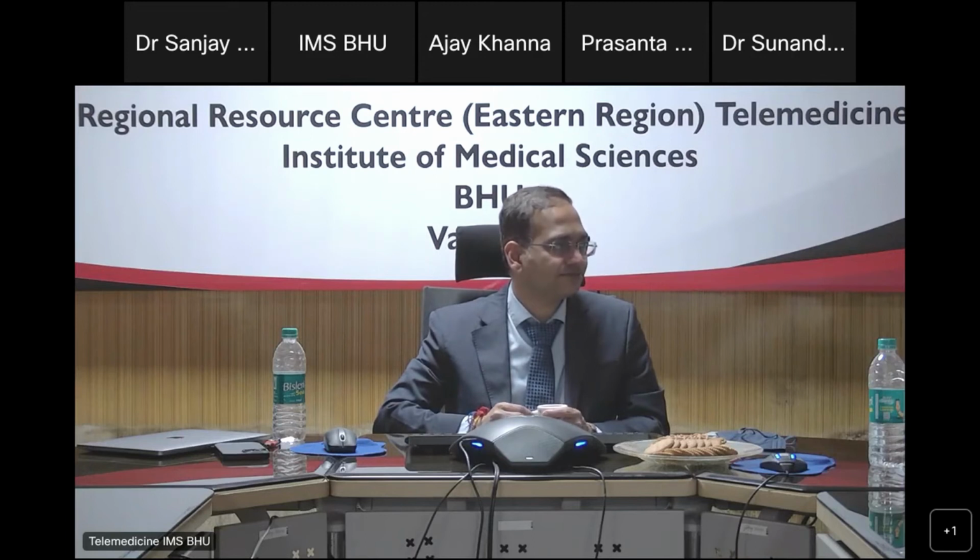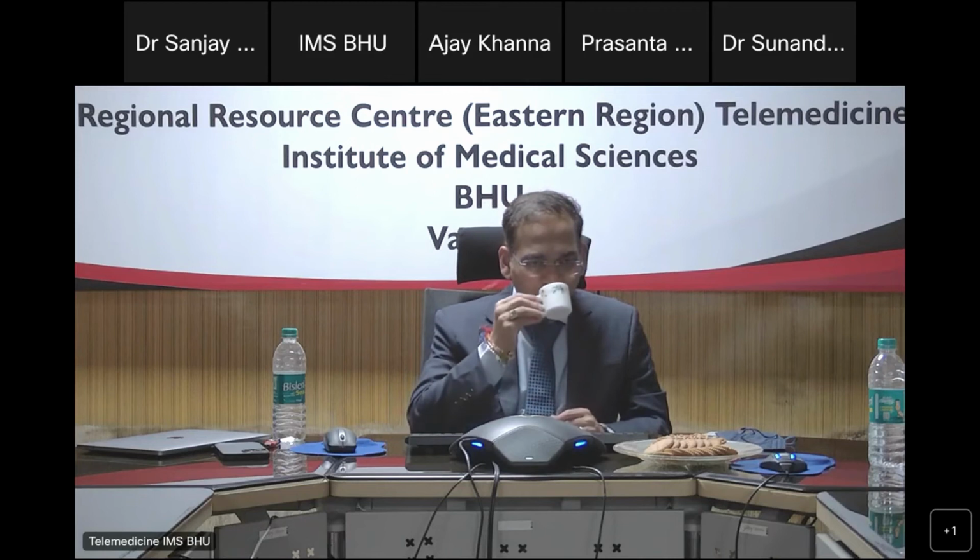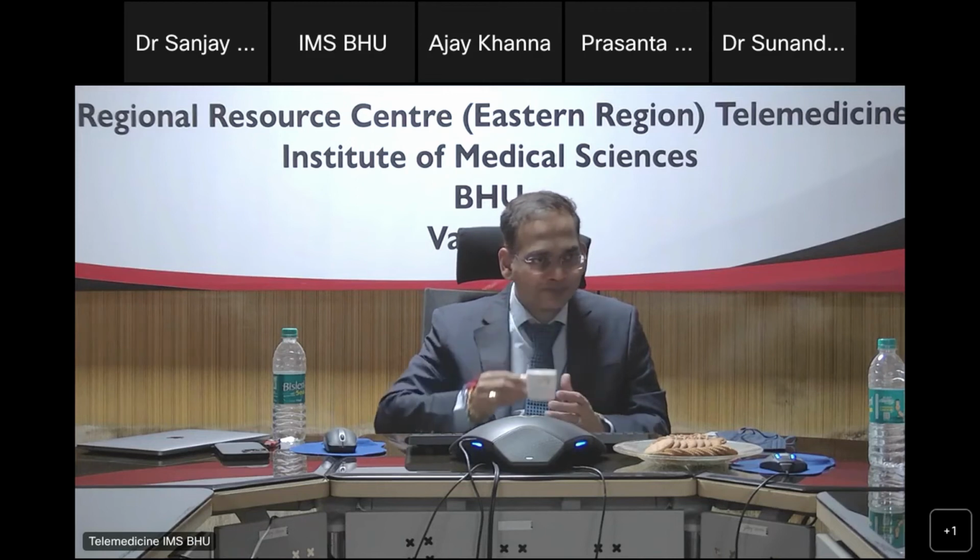So now you just spoke about MR as a modality. In your cases also, I think you have had a lot of good quality CT scans, but fewer MRs, I would say, not none at all, but fewer MRs. So why is it like that? That question may have been arising in many of our minds, so I'm asking on behalf of all of us.